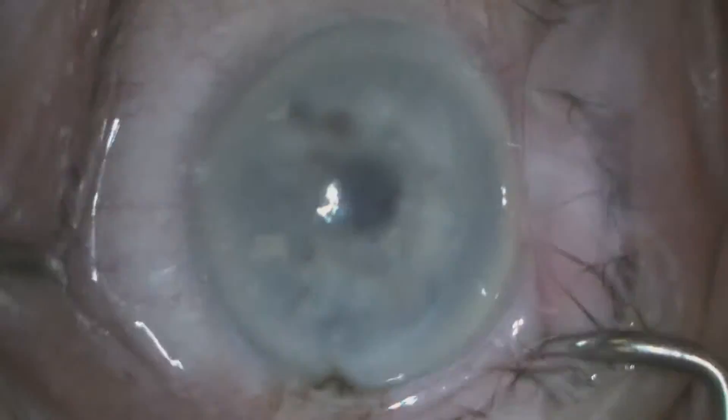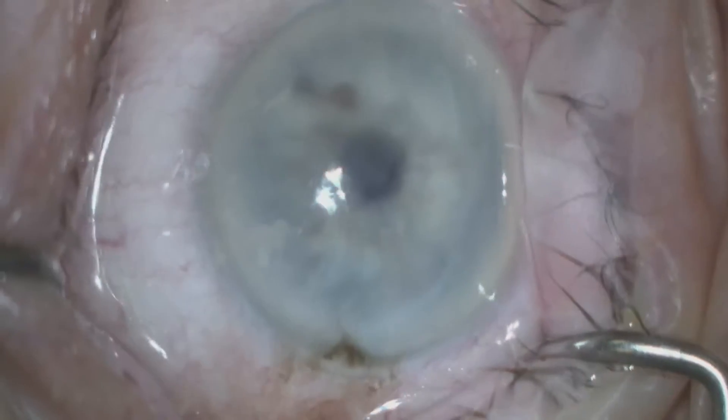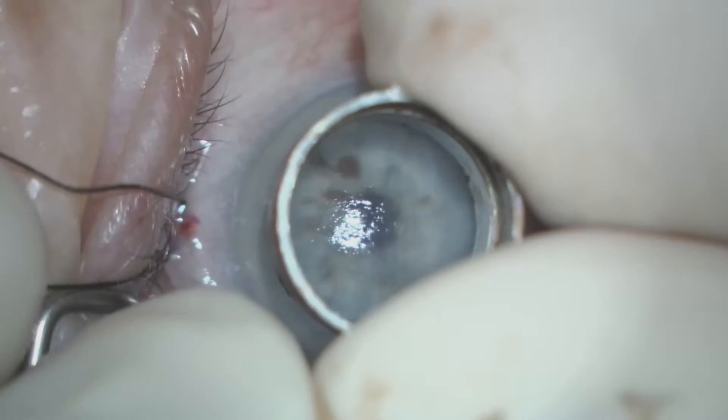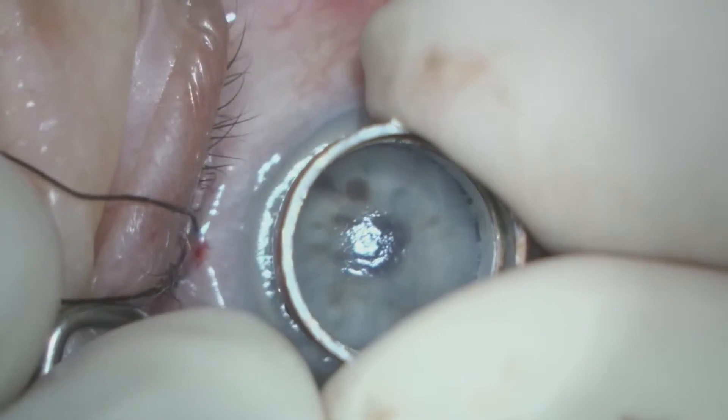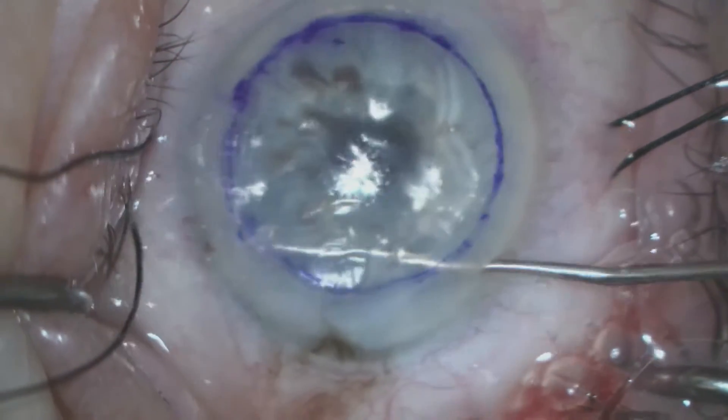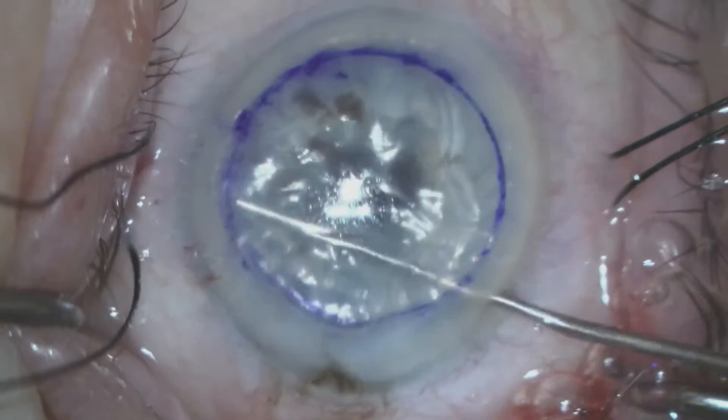In the operating room we can see the cornea is cloudy and we have anesthetized this eye with topical anesthetic. We've placed some bridal sutures to secure the eye and then we pre-mark the corneal epithelium with an 8 millimeter trephine.